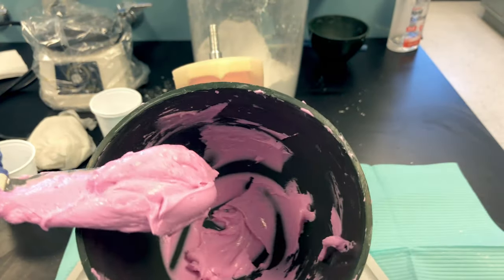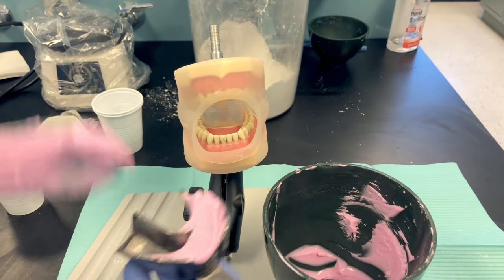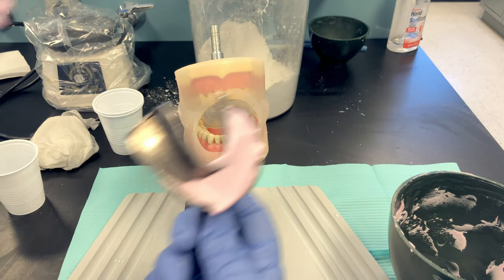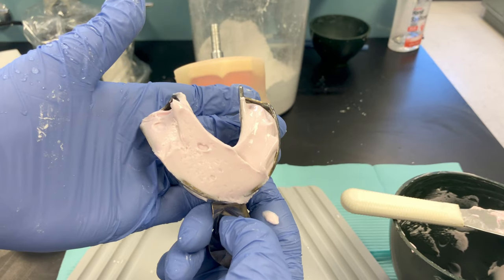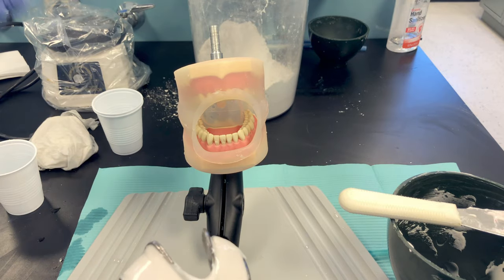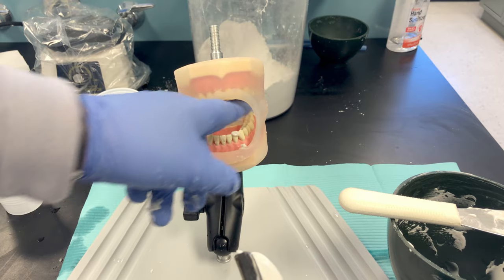Take half of the material and load the tray from the lingual side, pushing it forward. Take the other half and load from the other lingual side, pushing it to the anterior. You want more material in the front than in the back. Dunk your fingers, smooth the surface with wet fingers, and take any excess off the back. Dry the patient's teeth with an air-water syringe or have them bite on gauze.